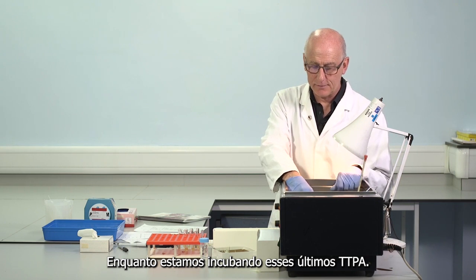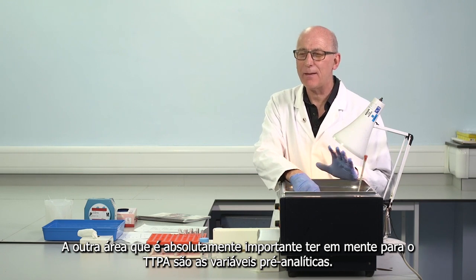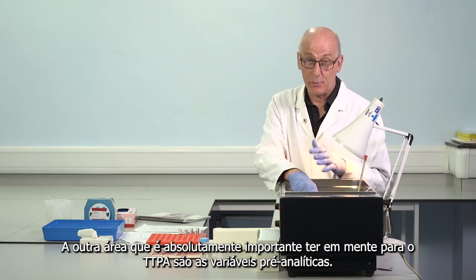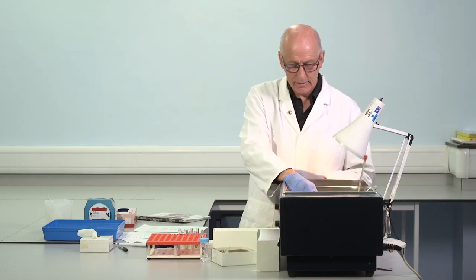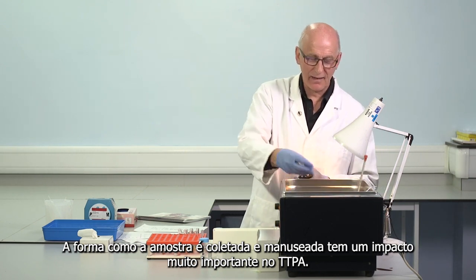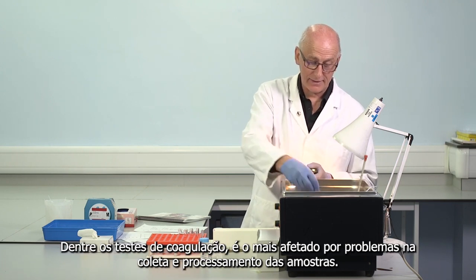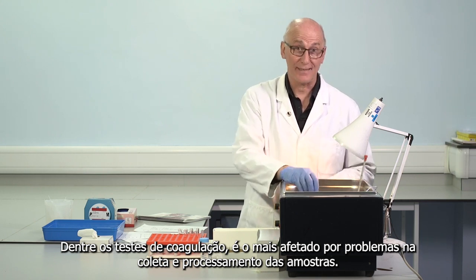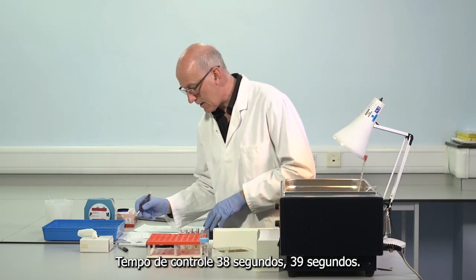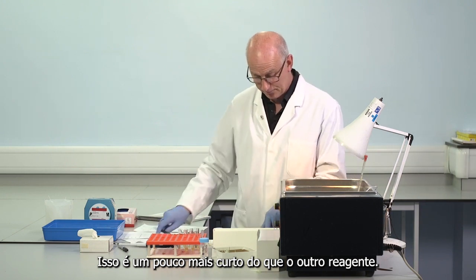Just whilst we're incubating these last few APTTs, the other area that's absolutely important to keep in mind for APTT are pre-analytical variables. It's the way the sample is collected and handled has a really important impact on APTT. It's the test amongst clotting tests which is most affected by problems in sample collection and processing. Control time 38, 39. So that's a little shorter than the other reagent.